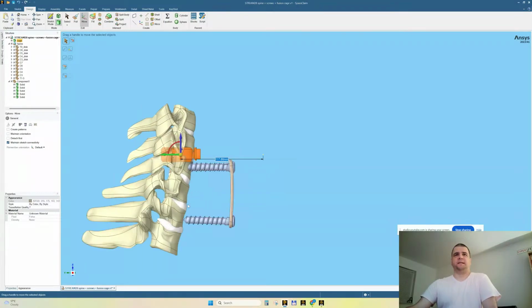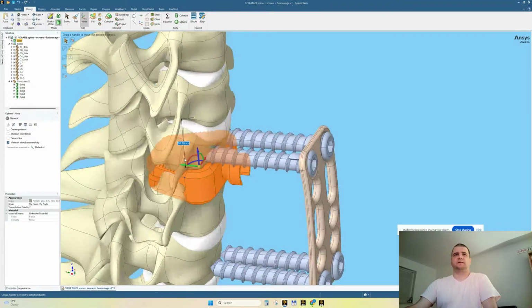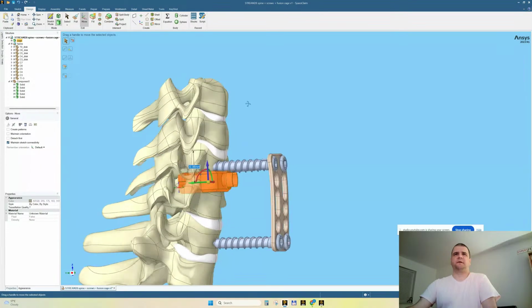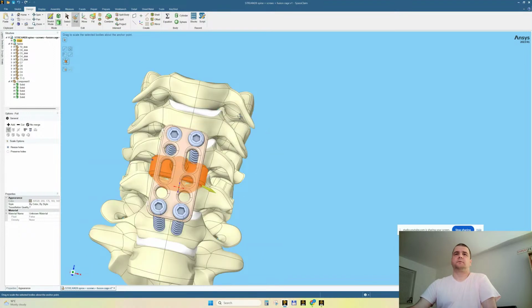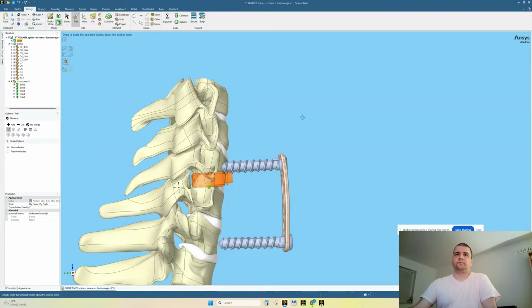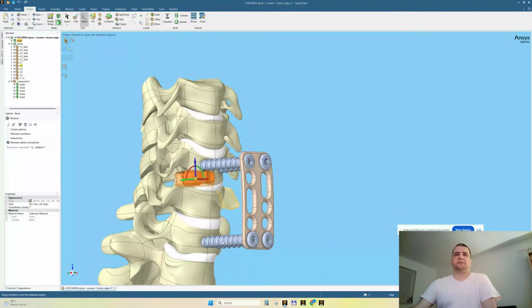This part should be here, in between. And it's too big. Okay. So let's scale it again with 0.85 maybe, or 0.70. Scale, anchor point. It remembered? 0.7. Maybe more is needed.